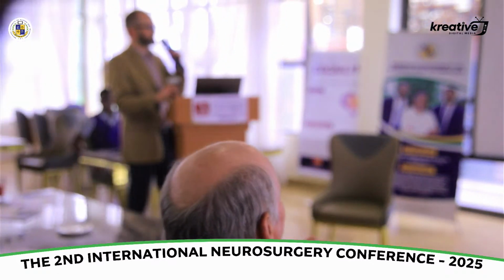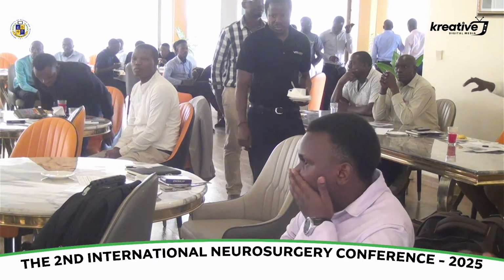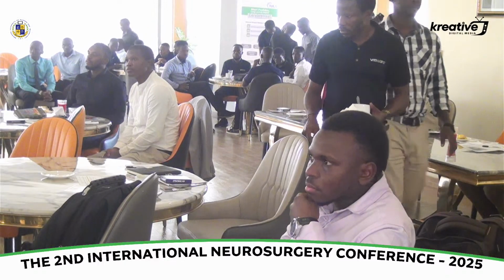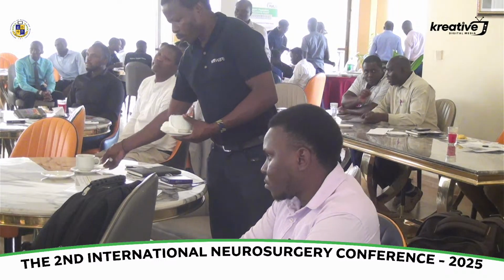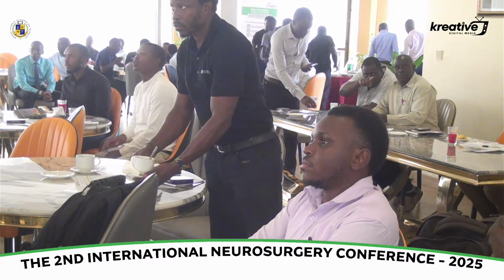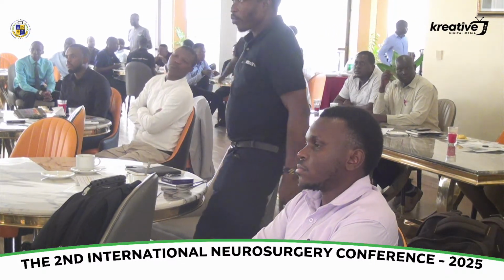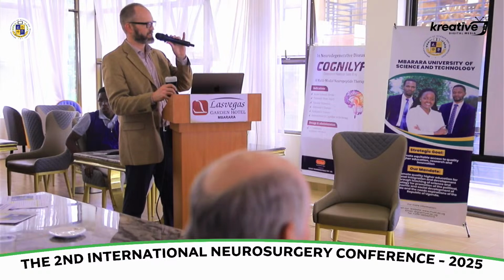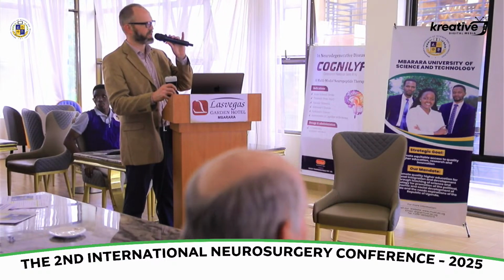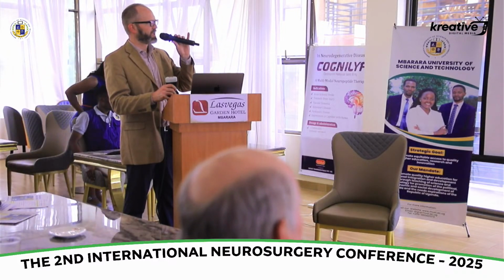As we look at this, at depth there's the orbital roof. If we look back, now you see there's the two lateral ventricles. So this model has hydrocephalus. Can you appreciate the lateral ventricles there? And the third ventricle, and then you can see those two bright areas at the base, that's the anterior skull base, and the middle fossa floor on the lateral sides.